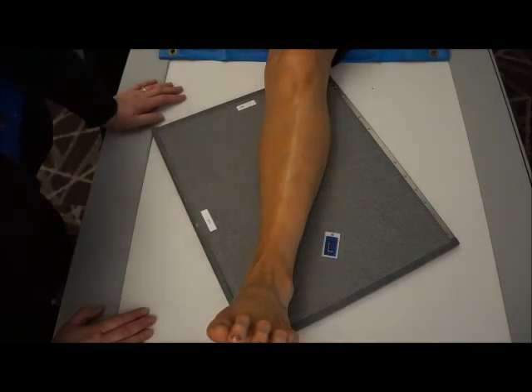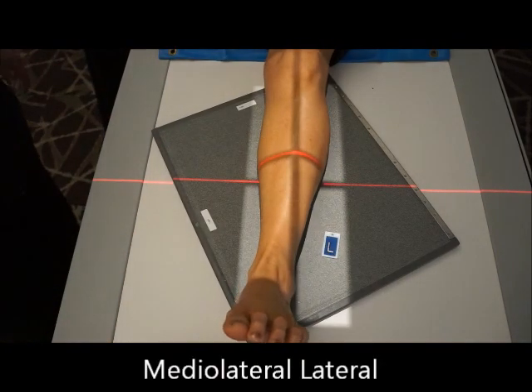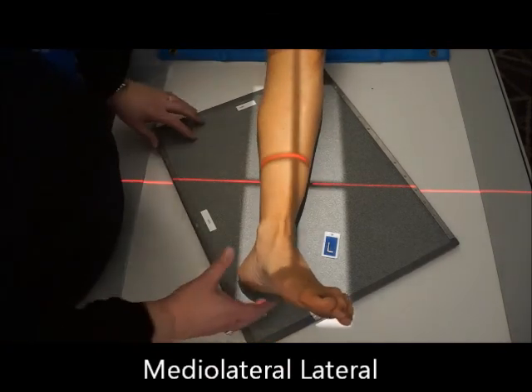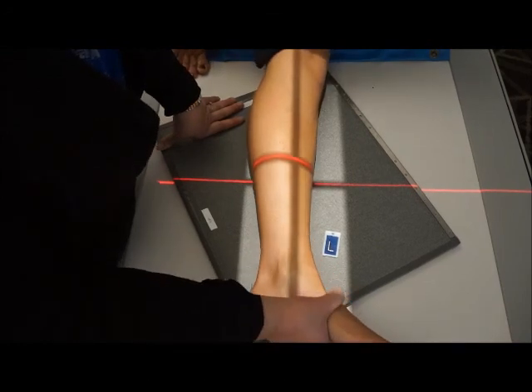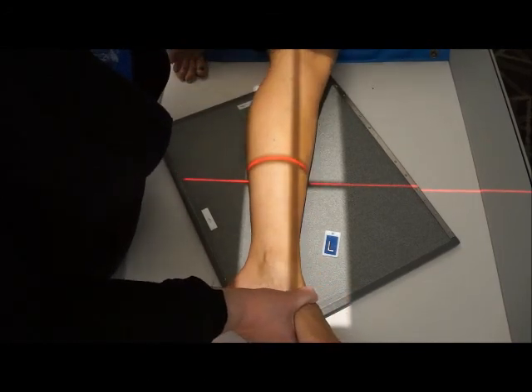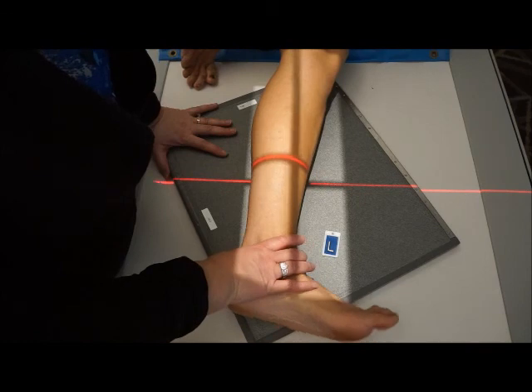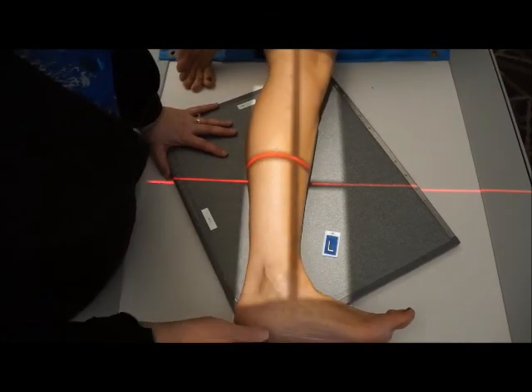From here we're going to turn our patient into a lateral. This is a mediolateral lateral. I'm going to get you to slide down here a little bit, a little bit more. I'm going to flex your knee just a little bit. I want you to slide down some more.